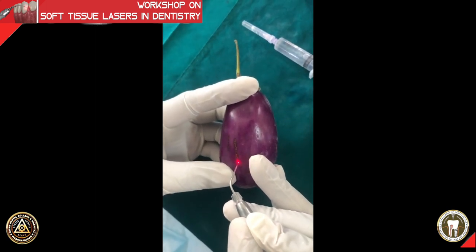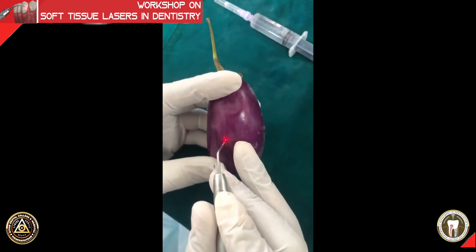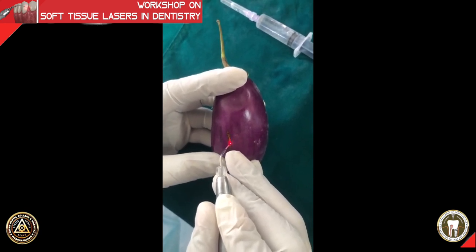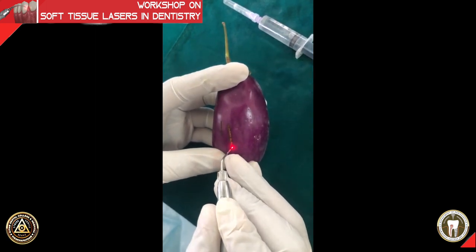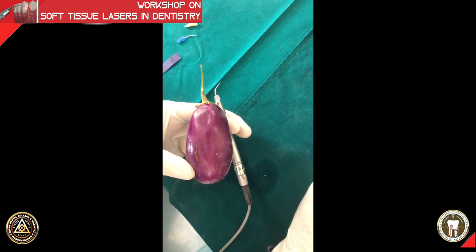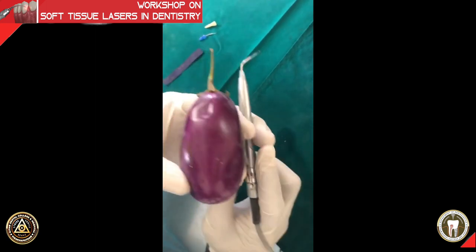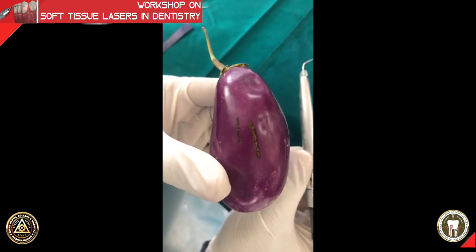The tip is end-firing only — the end will work, but the sides of the tip will not. You have to remove tissue only layer by layer: give an incision, then repeat in the same place and same direction again, moving the tip in light contact mode. This is what helps increase the depth of incision. You can see that the area has become slightly blackish, because continuous wave results in more heat transfer.